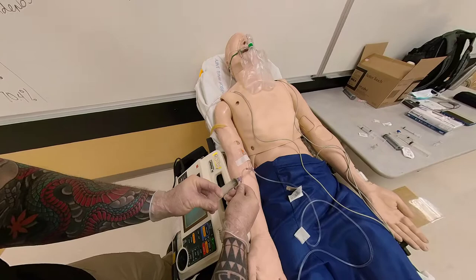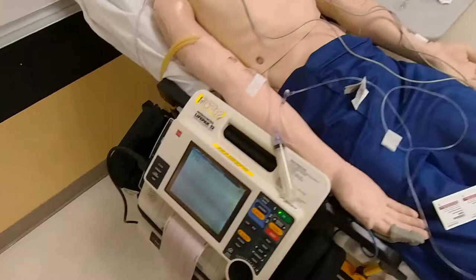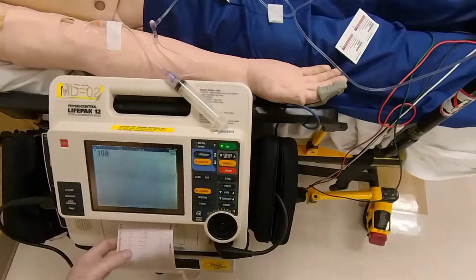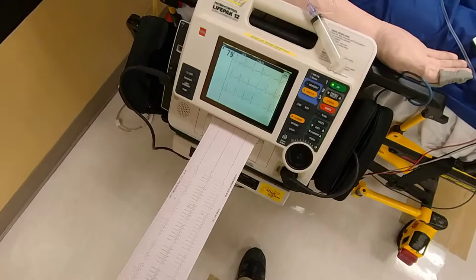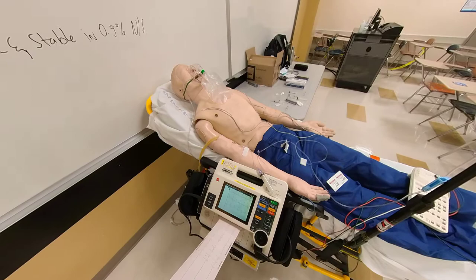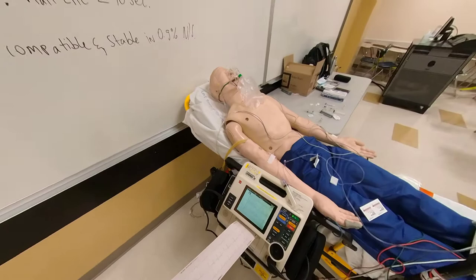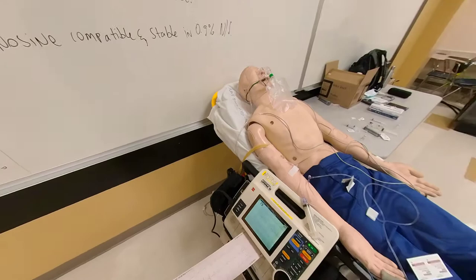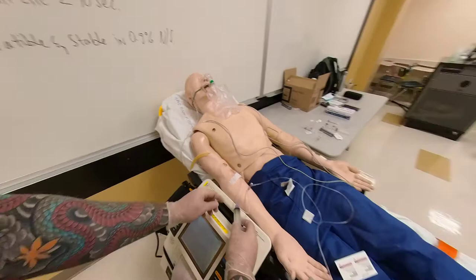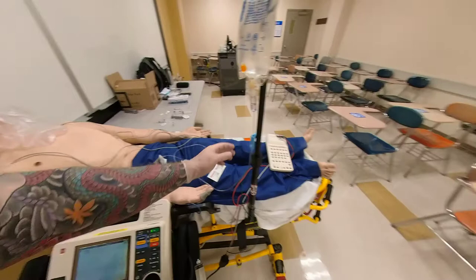In one continuous motion I give this rapidly over one to two seconds. I gave the medication, and then I observe the patient for a change in rhythm. You can see a change here — the patient has a brief episode of asystole and then returns to a normal sinus rhythm. At this point, it's very important to monitor the patient: obtain their mental status — name, where they are, what date it is. Get another set of vital signs: blood pressure, heart rate, pulse oximeter reading, respiratory rate. Obtain a 12-lead ECG to see if there are any other abnormalities. So this is essentially how I would give this drug — quickly bolus the medication, observe cardioversion, then initiate IV fluids and monitor the patient.